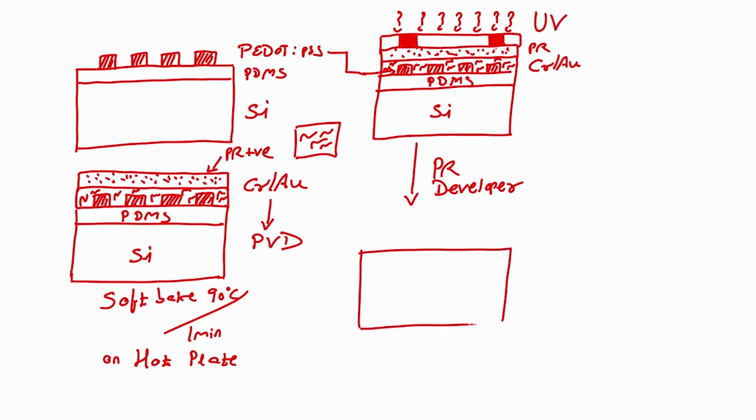We will have photoresist protected only on these two areas, right.